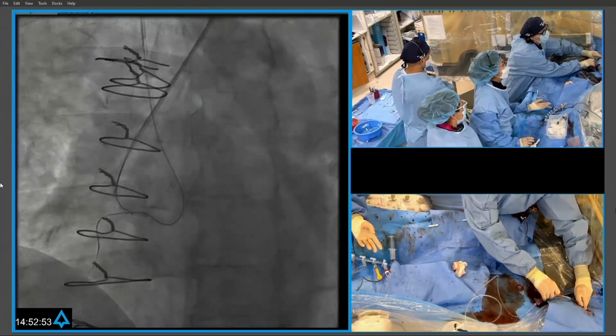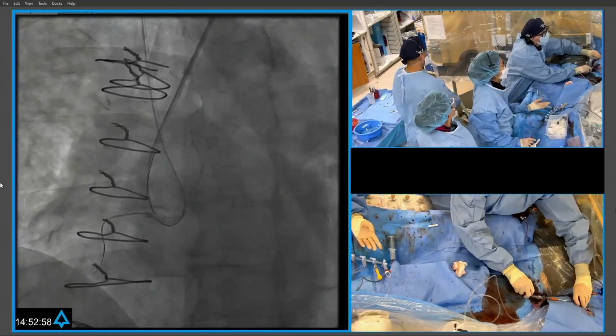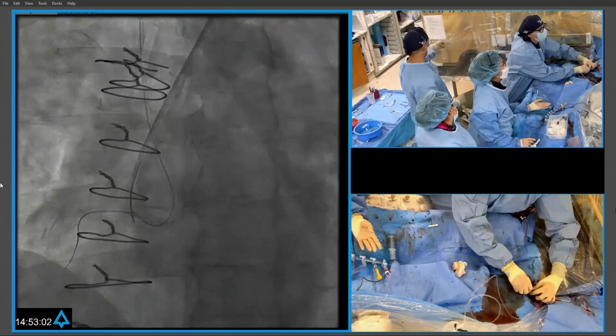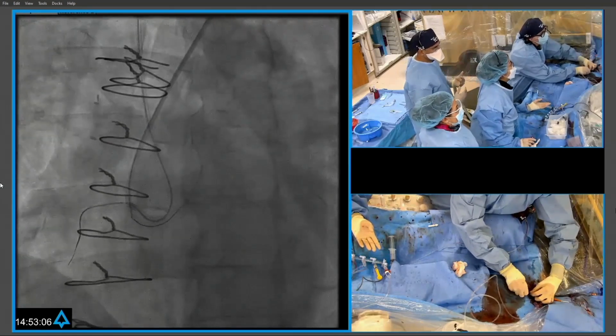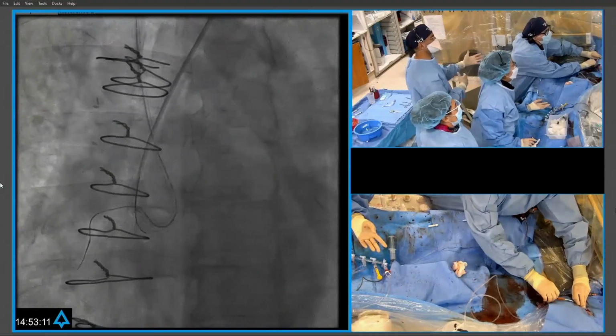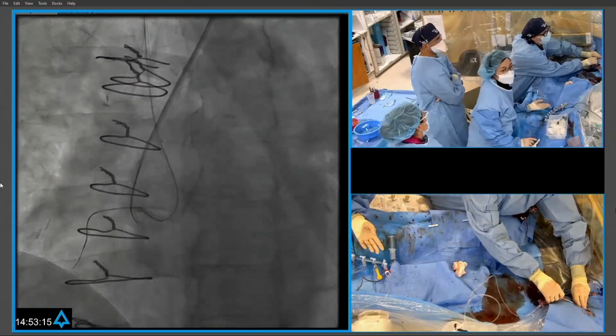Brian's wearing lead, and will come around to the front and do it. What's cool actually about not just this system, but when you start thinking more about radiation, we actually have another shield set up there to reduce their radiation as well. I think it's emblematic of when you think about radiation as a whole, which we don't often do, you then start doing other things that are important as well to limit the exposure, as you've seen.